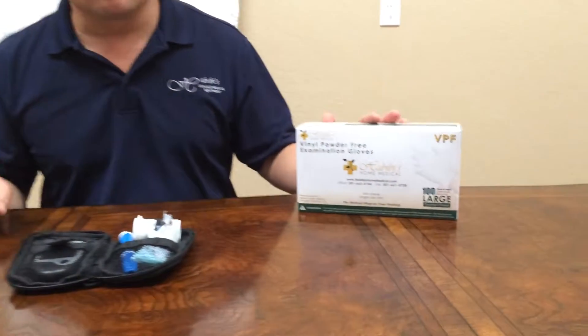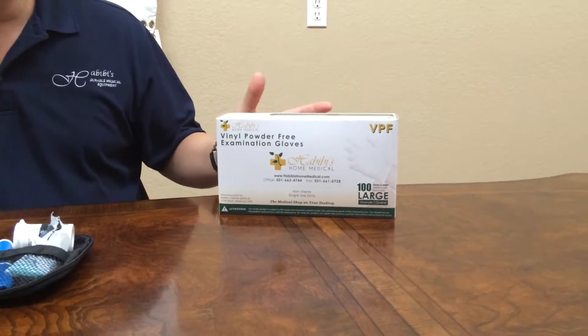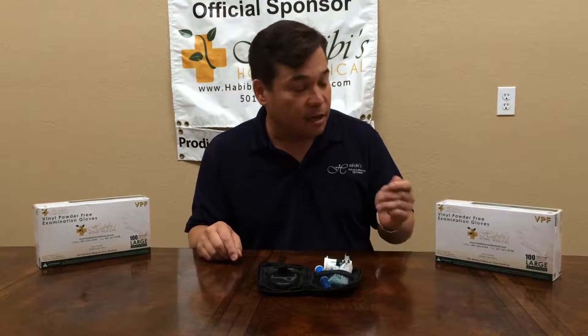Now before we get started, before you do any training, I would like you to glove up. We would prefer that you use a vinyl powder-free glove, as there are problems with latex allergies, and we will be inserting a needle underneath the skin, which could cause possible problems with allergies.